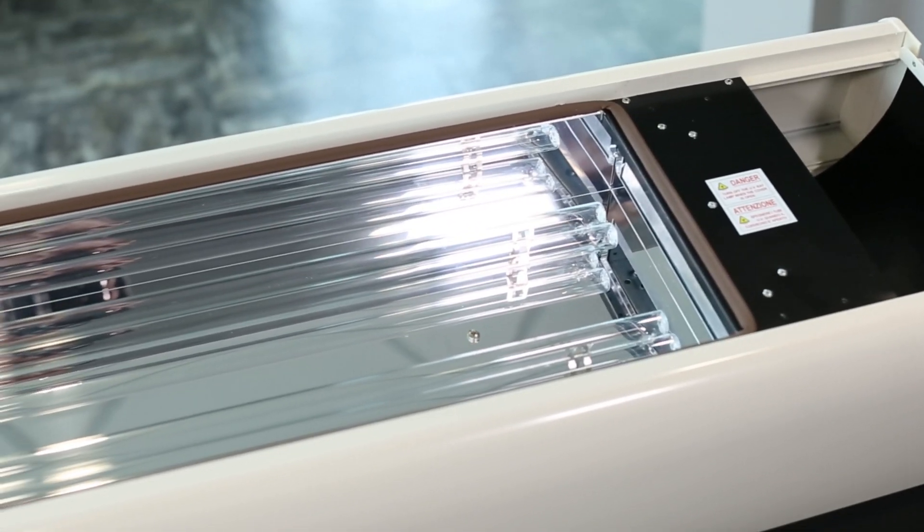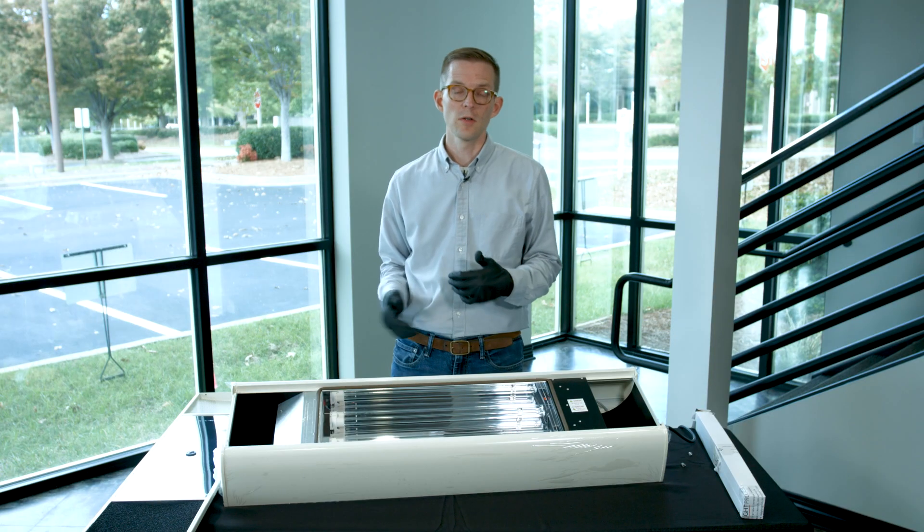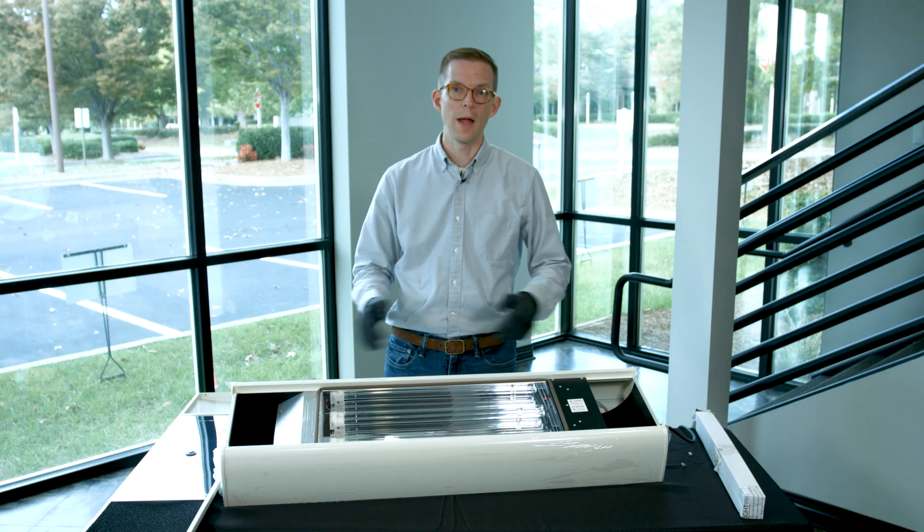Now that I have both of these lamps installed, I'm going to replace the cover, put the screws back in, and then we'll power this unit up.